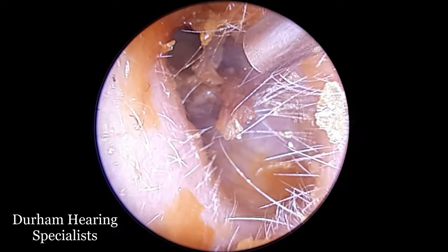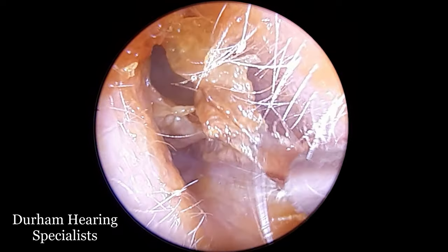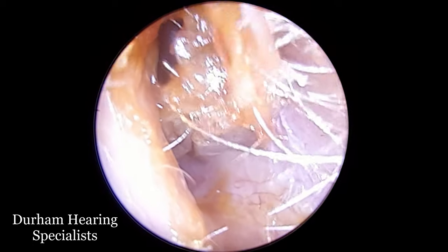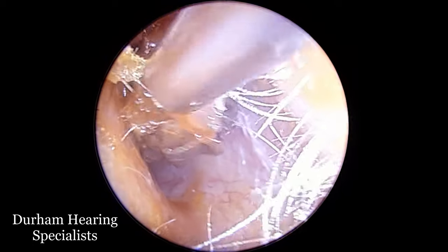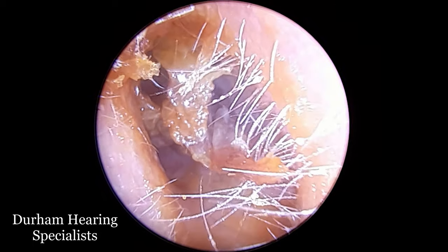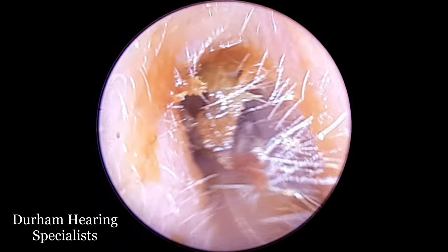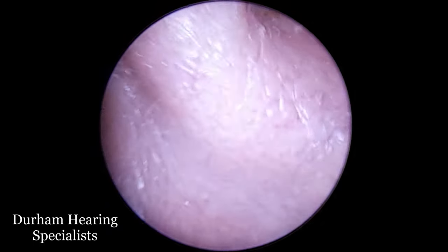So I'm going back in now with a fine end. You might notice that the suction probe looks a little bit thinner. The idea behind the fine end is that the dead skin won't be sucked partially inside and flap away. That's what we call clarinetting — it makes a sort of squealy sound in the ear, which is rather unpleasant for the patient.